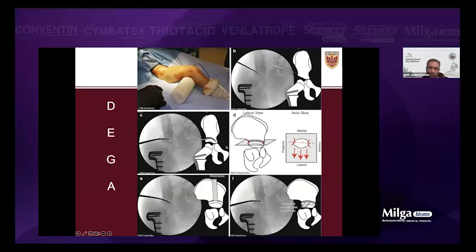Dega osteotomy or San Diego or whatever you call it, Paley modification of Dega, it's all Dega osteotomy. It's all the same, and this is what we described in the first case. So here's the patient position, and you do the Dega. I start with a straight osteotome.